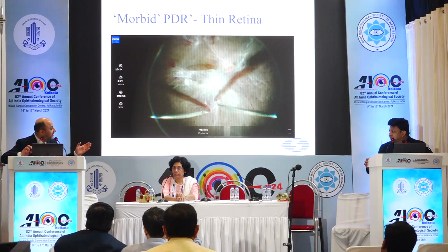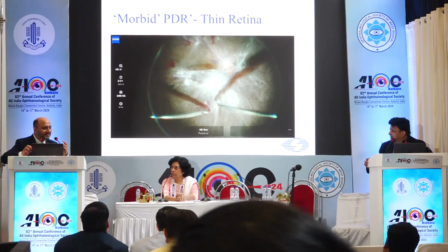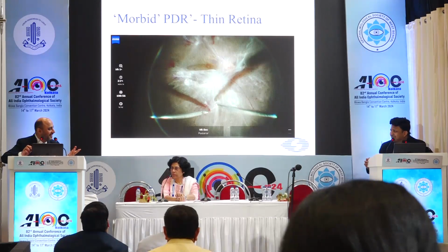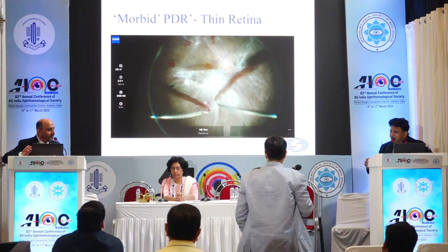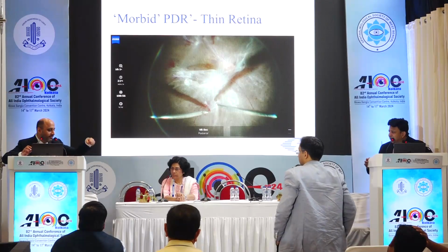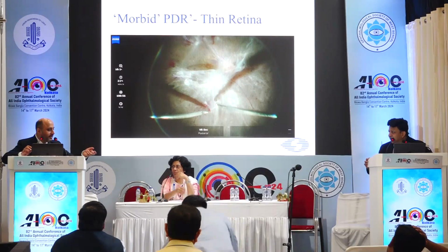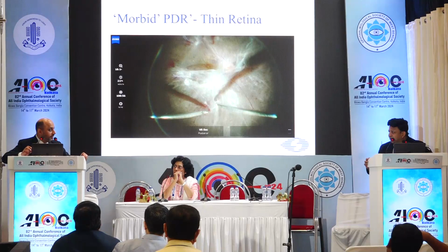Coming to cases like these, I would never attempt what you do, and the case that you also showed, I would never have been able to attempt what you did. So I think that's really, really brave. I just wanted to know one thing: if you have a bleed, my biggest fear is, you lift it up, and in the beginning you might not get into the right plane or you don't lift it completely, and you end up with a large bleed.